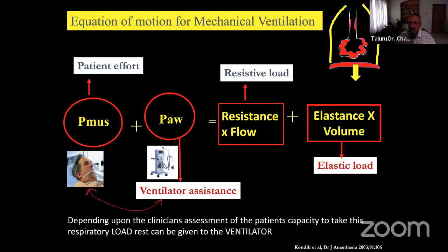So there are different modes. Some modes are only for safety. When you are ventilating in anesthesia, our only goal with controlled ventilation is safety. There is no question of comfort because there is no interaction, and weaning doesn't happen unless we reverse. So that is a different ball game.